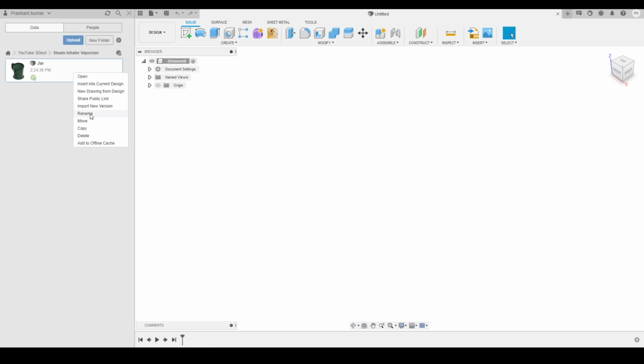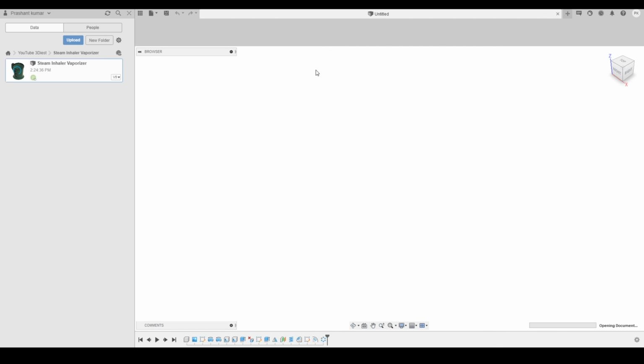So I'm going to rename this file before moving forward. I will give it the name steam inhaler vaporizer. The reason I'm doing this is because inside this particular assembly we had lots of different components, so that's why I'm changing the file name, and then I will open this whole component.